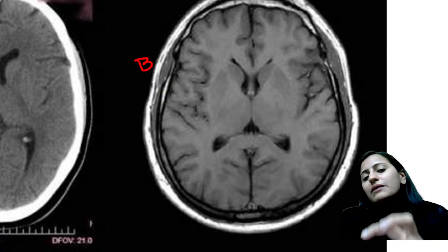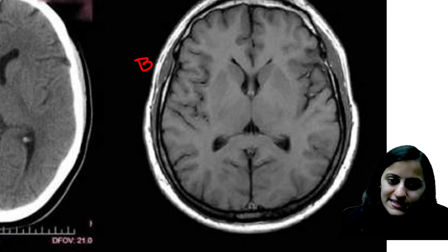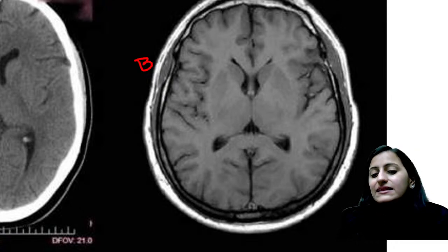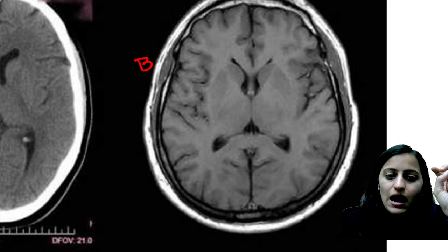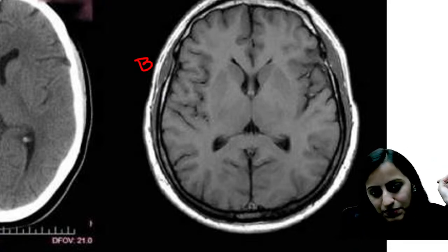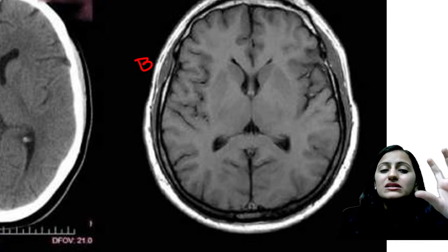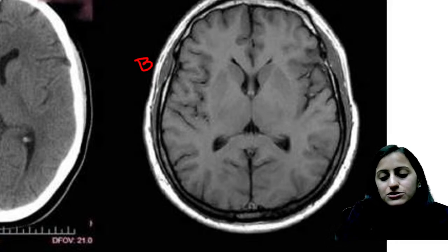Fat appears white on MR, T1 and T2 weighted MRI. The bone is this, just outside the brain parenchyma. This thin black line is the inner table of the skull. The outer black line is the outer table of the skull. And in between, the white color that you see is the bone marrow, the diploic space containing fat, which is appearing white. Fat is white on MR.